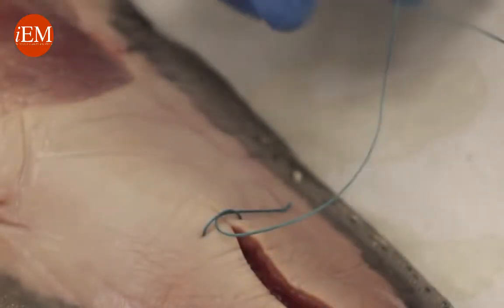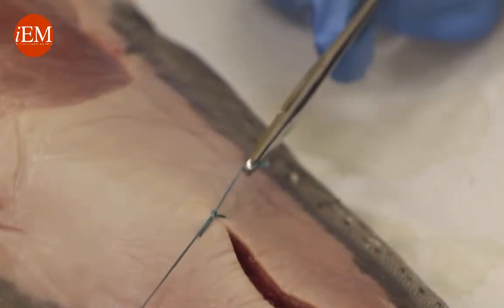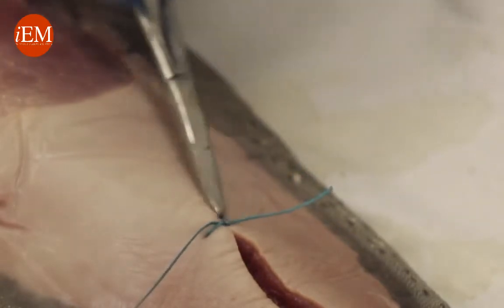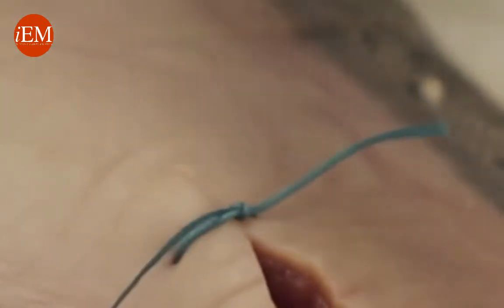Then again, grab it once and grab the tip, pulling in the same direction as before. Now I'm going to make it too tight — you see how this is too tight. But I want to loosen it. You see how it becomes loose. Now I know I'm going to get the right tension. This is what I want the skin to be.